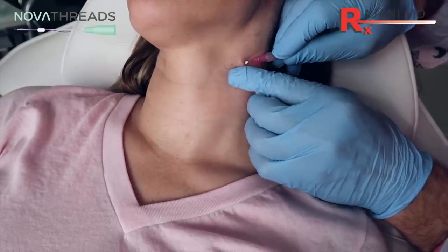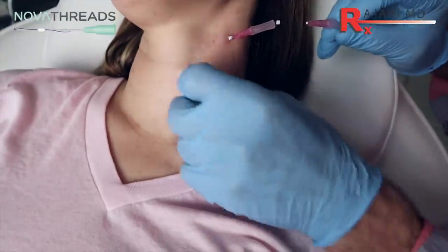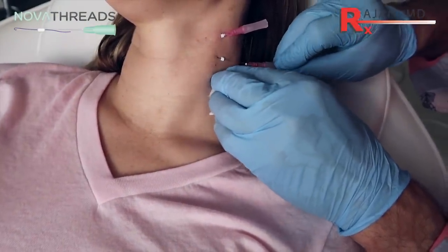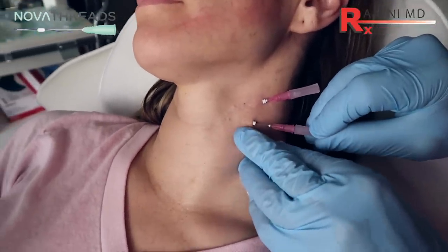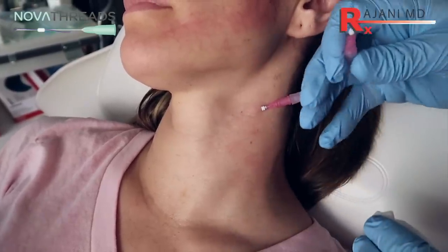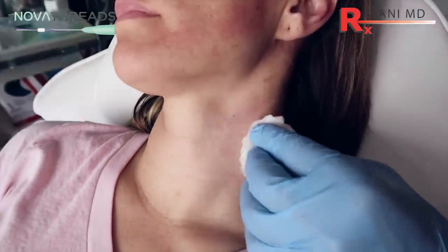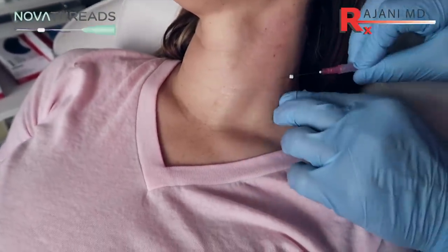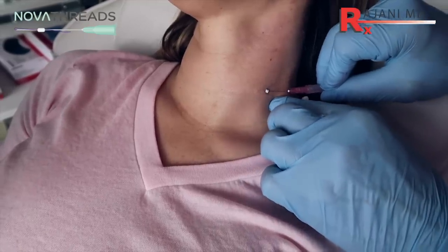PDO sutures will be in there for about four to six months, dissolve, and then they will leave. Whatever collagen is produced will be there for up to years — it's the patient's own collagen, they get to keep it. The aging process is dynamic, so it continues; however, we can help prevent it. This may not need to be repeated for a long time. So these, as opposed to the barbs, we just put them in — we're going to come to the lower line here, put them in and they're already engaged, then we remove them.